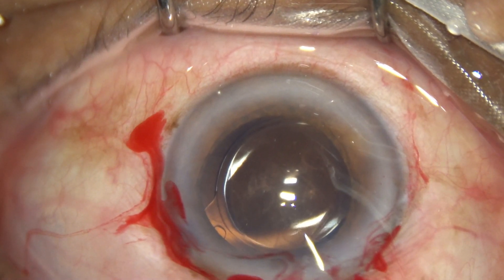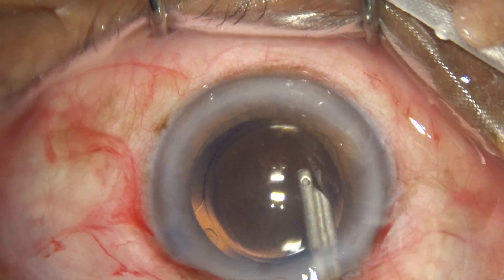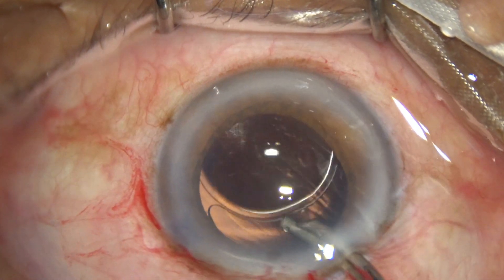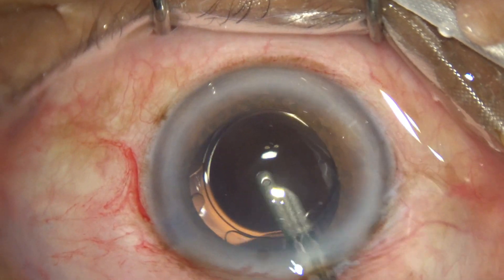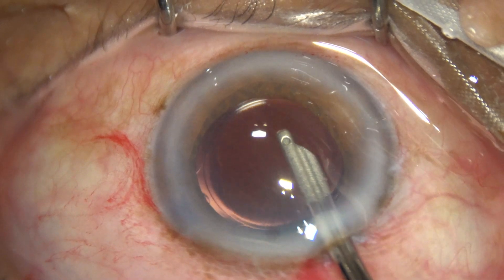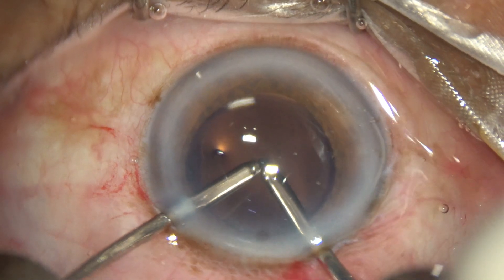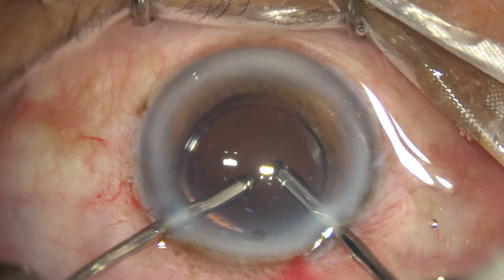The haptics are placed 90 degrees away from the main wound so that I can easily go behind the lens to clean the viscoelastic. The Simcoe cannula is used to irrigate the anterior chamber and the capsular bag, followed by bimanual irrigation-aspiration cannulas to further irrigate and aspirate the anterior chamber as well as the capsular bag.